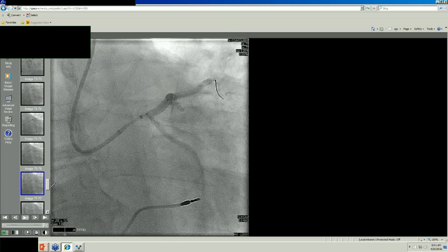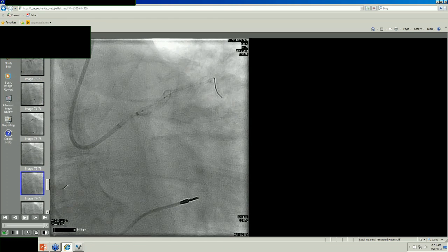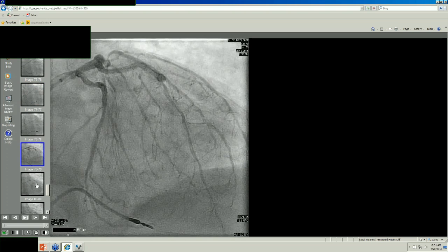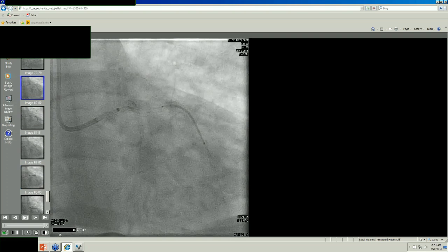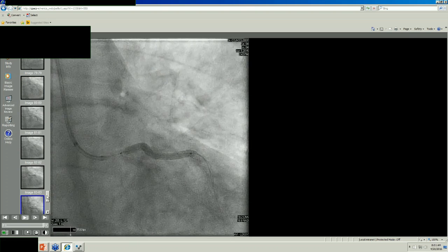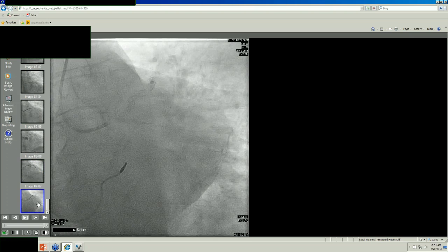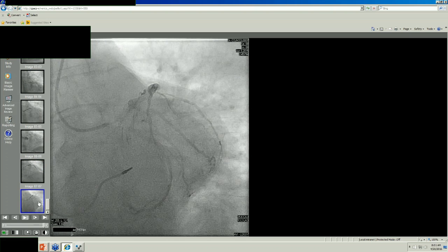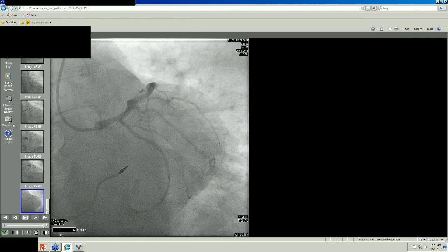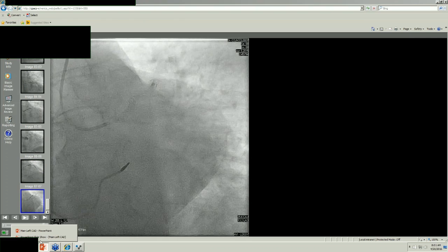And that stent is extending out a little bit into the main left. So I don't know what the future is for this one, because it's almost like the main left got angioplastied but not stented. The stent just pokes out just a little bit. So here's the results cosmetically. So let's go on.